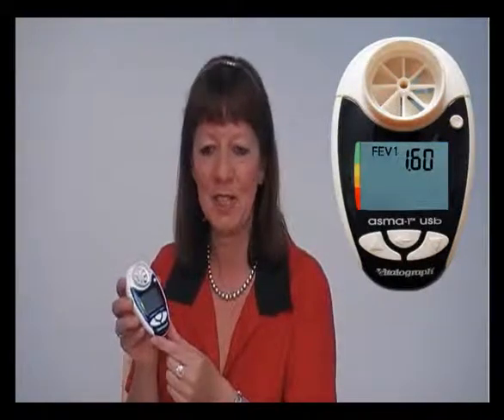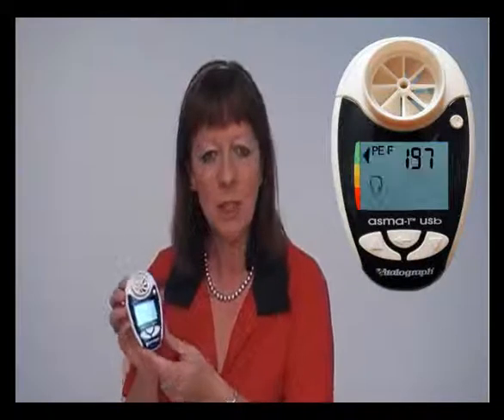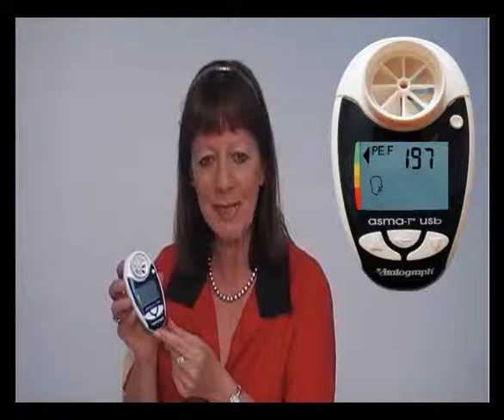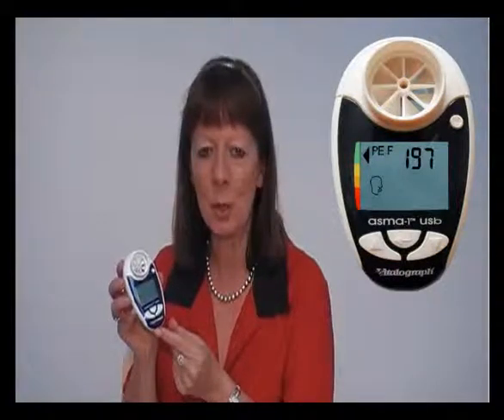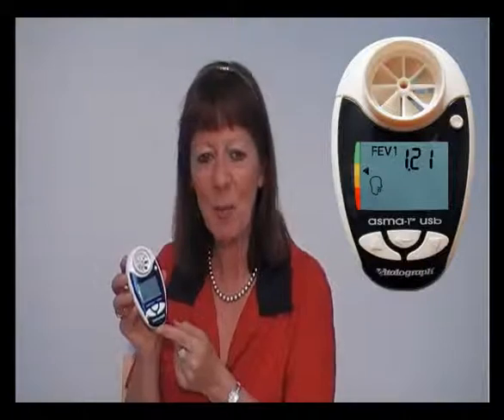When you have your own personal best programmed into the device, after every test it will display an arrow on the left-hand side of the screen to show which colour zone you are in, based upon percentage of your own personal best. Even the colour zones can be modified if necessary by a healthcare professional.